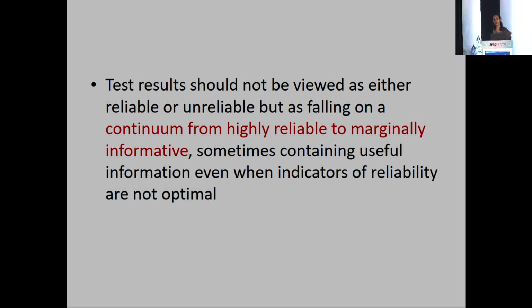Test results should not be viewed as either reliable or not reliable. Actually, you should start seeing them as a continuum from highly reliable to marginally informative. You should not discard the test report solely based on the reliability indices. If the reliability indices are not that great, you have to read the report with a little more caution.